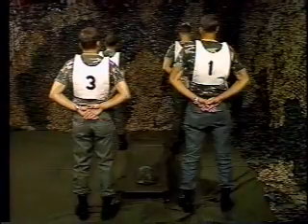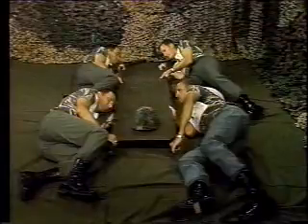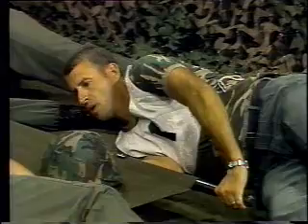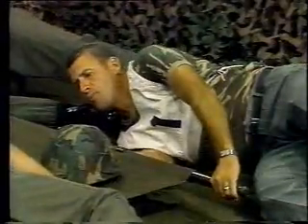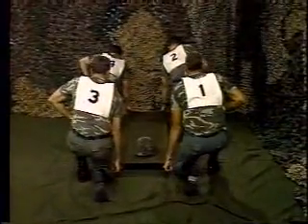Demonstration team. Low crawl carry, move. Under the team leader's command now, giving the ready and the lift, they will move the litter into the air and slightly forward. Ready, lift. Continuing to crawl up with the team. Ready, lift. Demonstration team, prepare to lift. Recover.